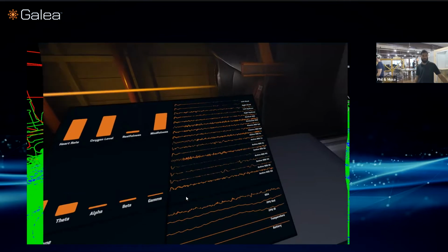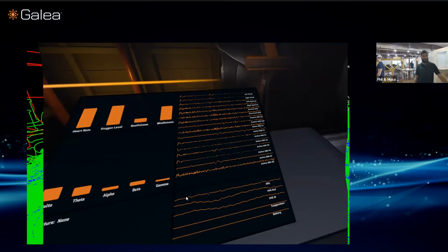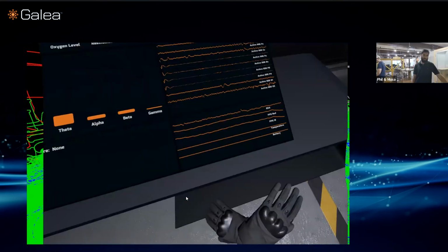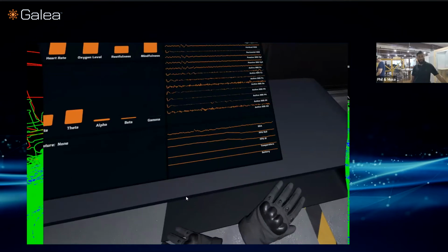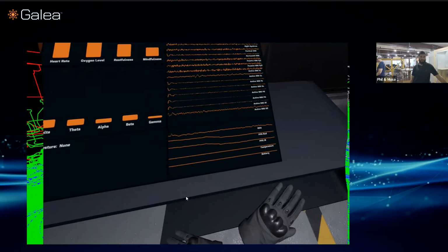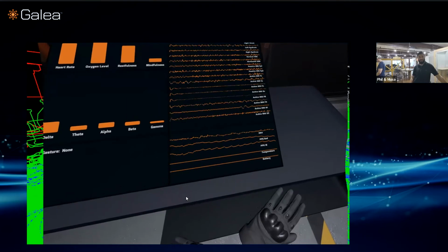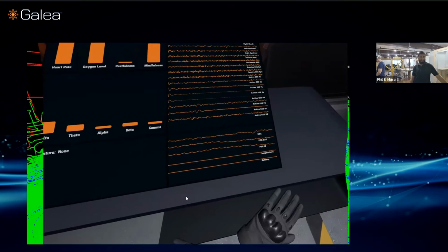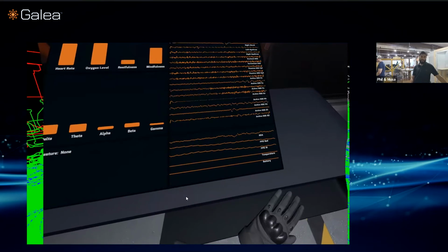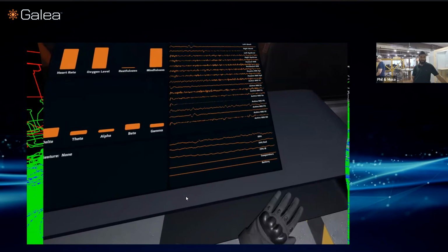So below all of this, your primary biometric data, we also have our auxiliary biometrics. The first of which is electrodermal activity, also known as EDA, which measures galvanic skin response. So this is useful for deriving metrics such as cognitive load and mental stress. And this is highly useful because your body responds to these stressors and cognitive loads physiologically.